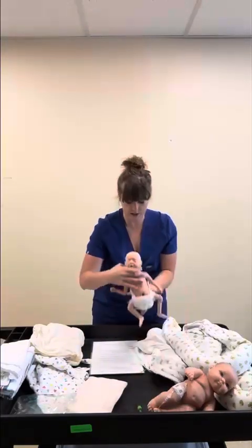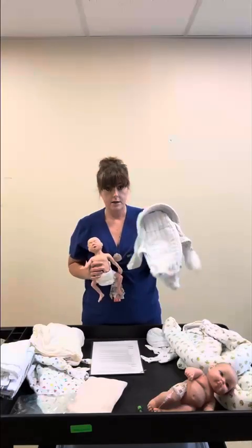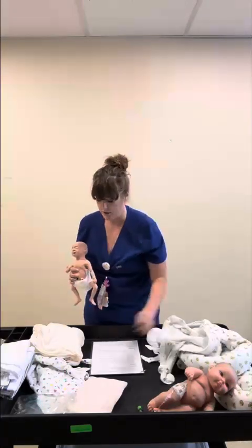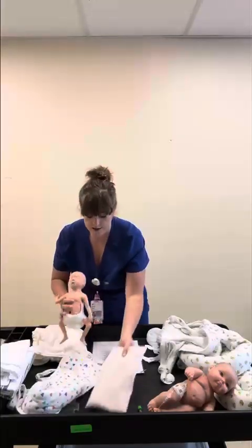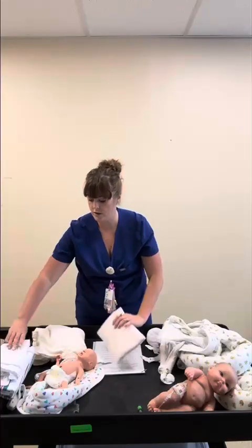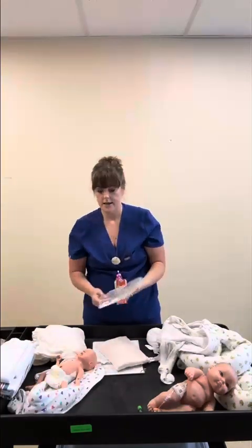This is gonna be our patient again, floppy. You can utilize either the RU2 or you can utilize the larger Snuggle Up, but we are gonna say that Z-flows are for prone positioning. We are no longer allowing blanket rolls, it's too stiff, and gel pillows are the opposite, too fluidized, and so Goldilocks right in the middle is your Z-flow, where you can mold it how you want it, and it can help with the baby.